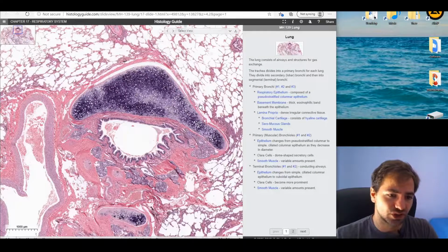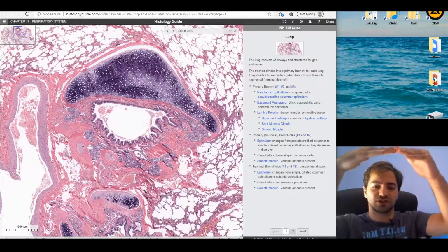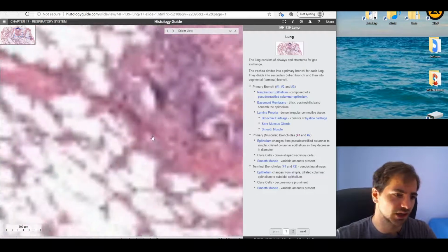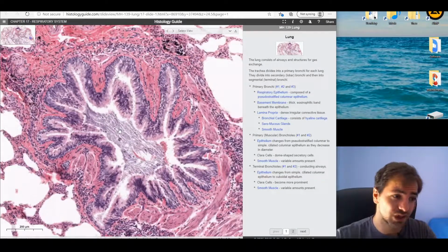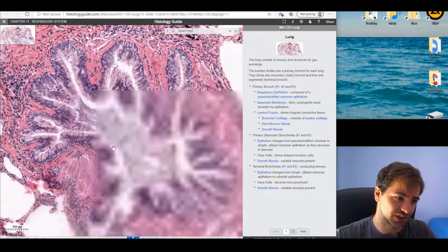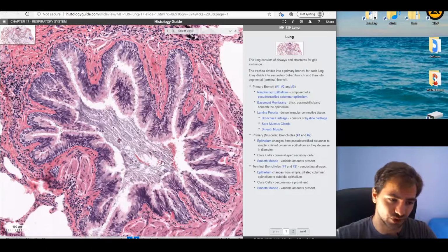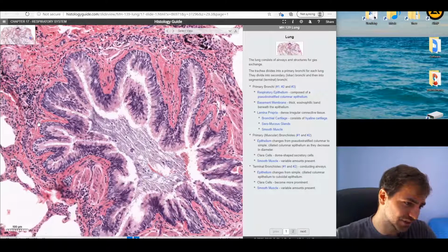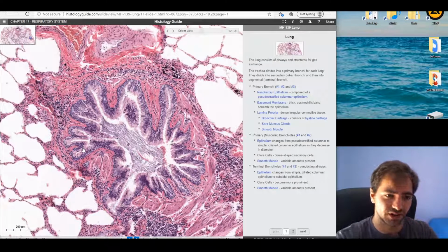Exactly after this, we're going to see the bronchiole. As you remember, we go from the pseudostratified to the columnar, to low columnar, to cuboidal, and let's see them specifically. As we can see, there is no presence of cartilage surrounding it. Easy to understand, there is a whole band of mucus present in the whole lumen of the mucosa. You can see here the very nice shorter columnar cells, and the structure is the same, basal membrane present. Again, there are scattered smooth muscle cells beneath the lamina propria, and that's pretty much the structure of the primary bronchiole.